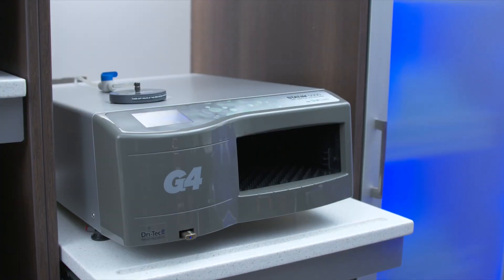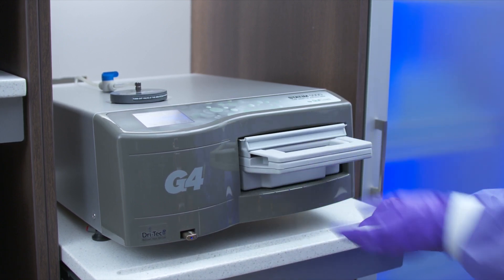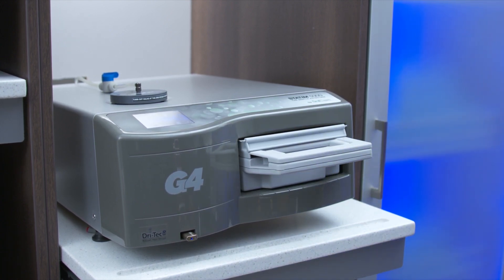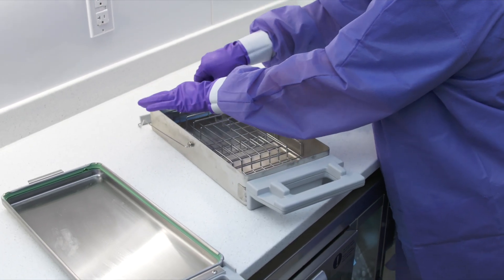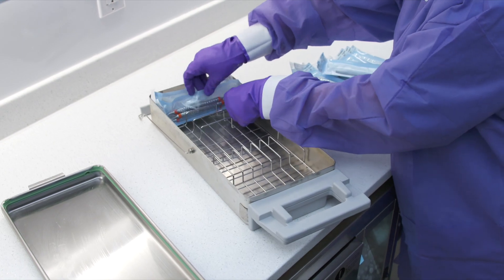The STATUM 5000 cassette is similar but has a handle that assists with the removal and insertion of the cassette. In addition, your STATUM 5000 unit comes with a wire pouch rack to help pouched instruments dry more efficiently.